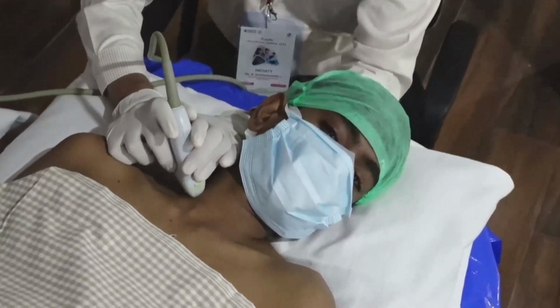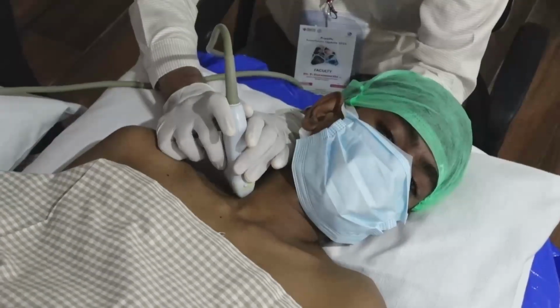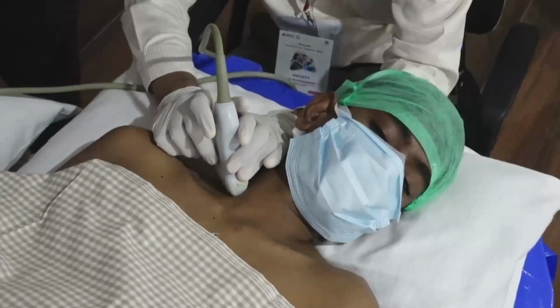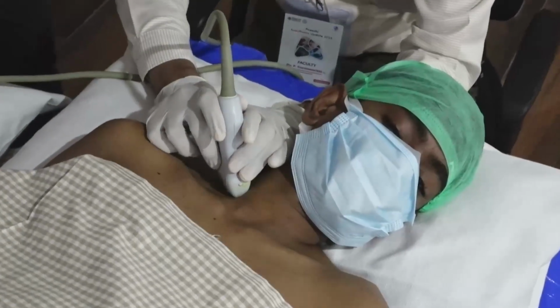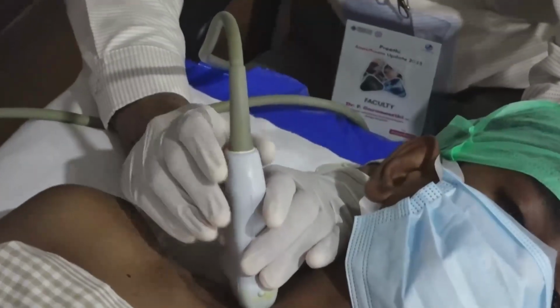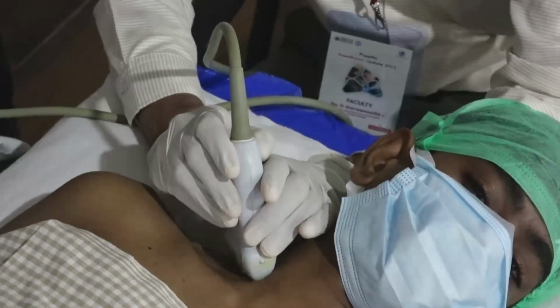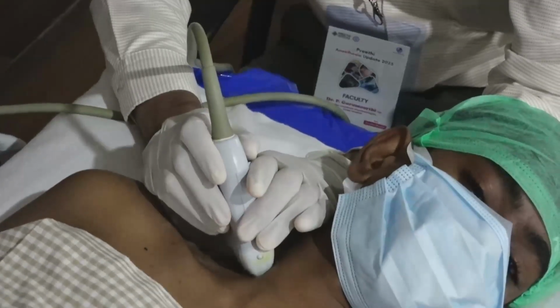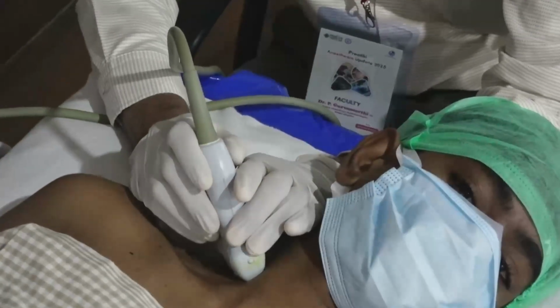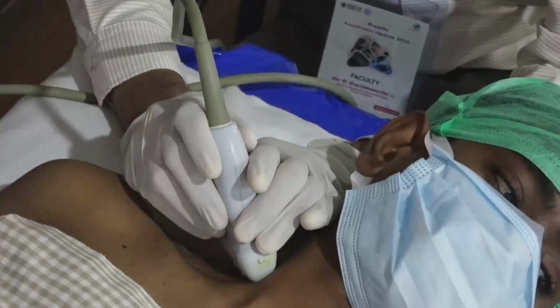So we identified C7. Now, always the moment it comes out, it usually divides. That is also important. Unless we know the division, it is easy to miss and misidentify, like sometimes we think that is an individual component. I will come to that later again. So now I will move on again. It is C7, as I described. It is going inside the foramen and coming out.